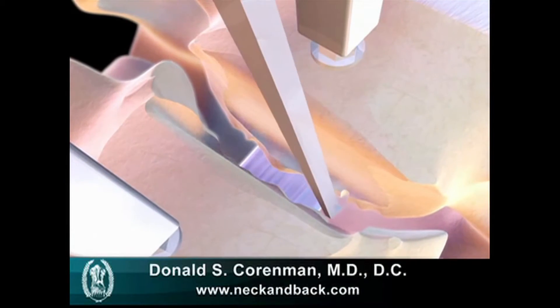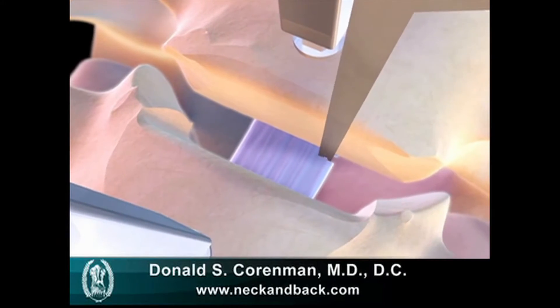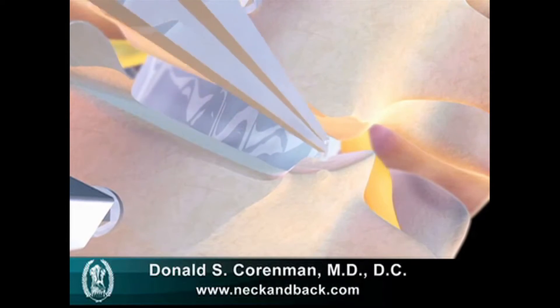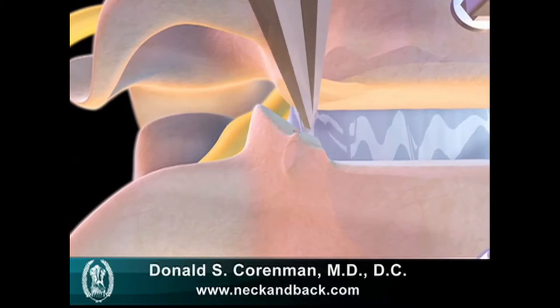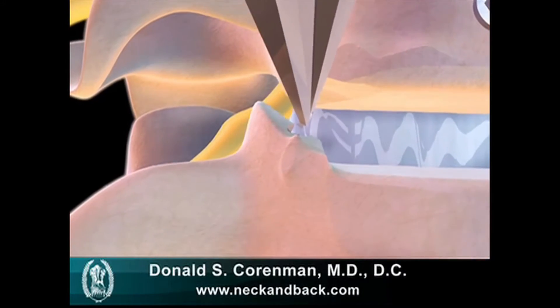You can also at this time remove the posterior bone spurs that compress the spinal cord. Also, you're going to remove the uncovertebral joint spurs which are pressing into the nerve root. The nerve roots you see here depicted in yellow. This tool, the Kerrison, is the device that's utilized to remove those spurs to free up the nerve root.